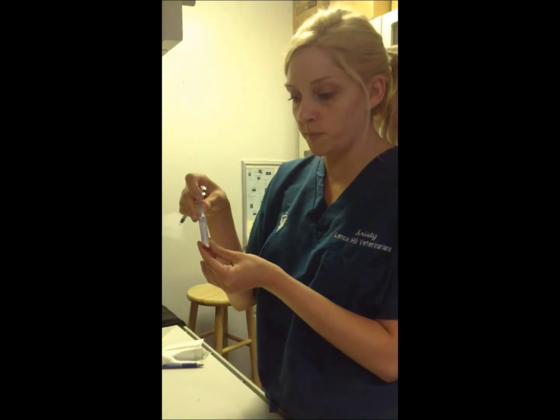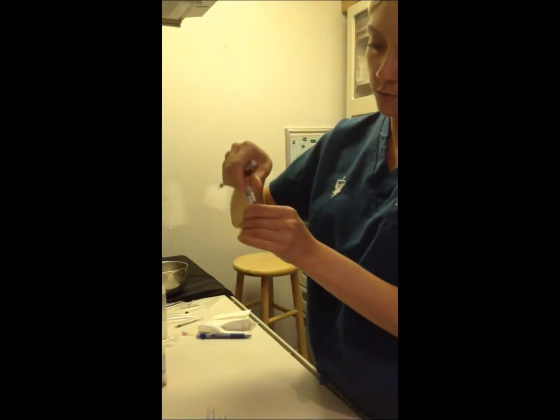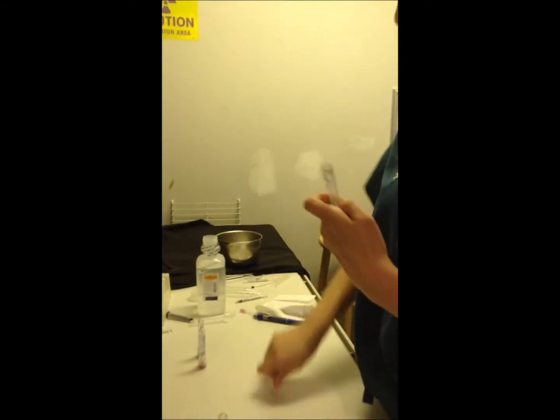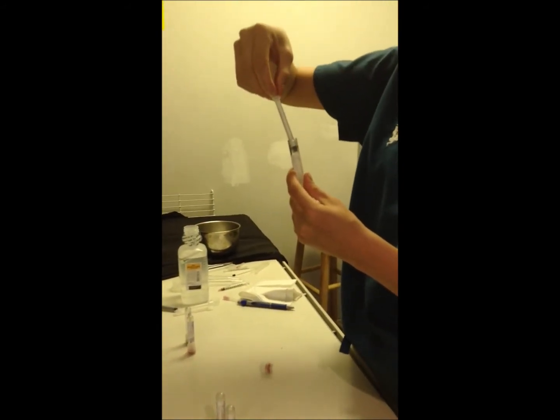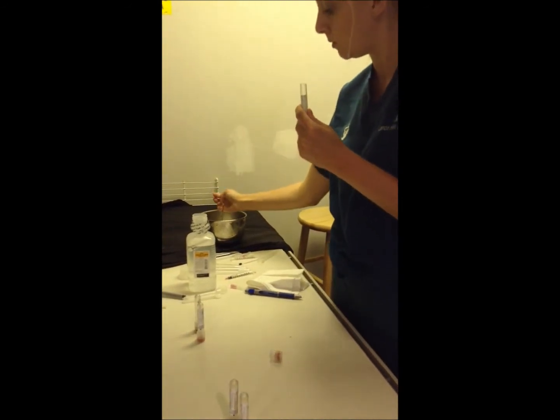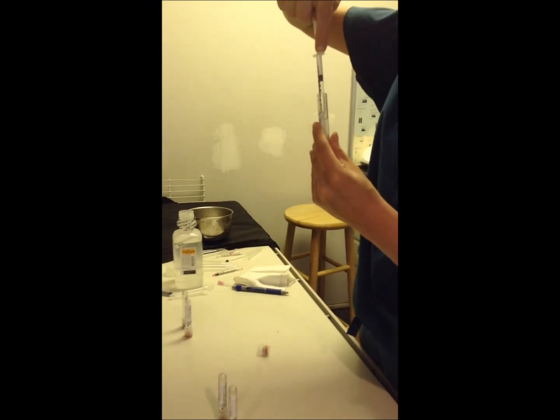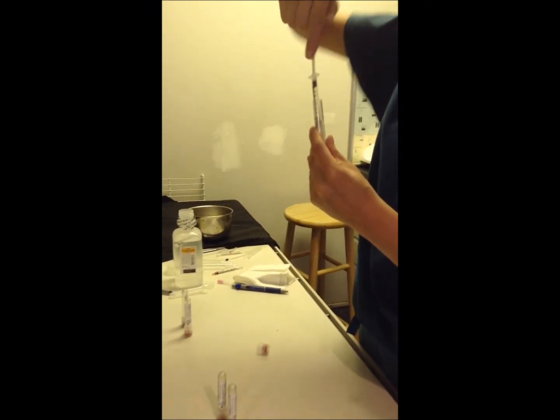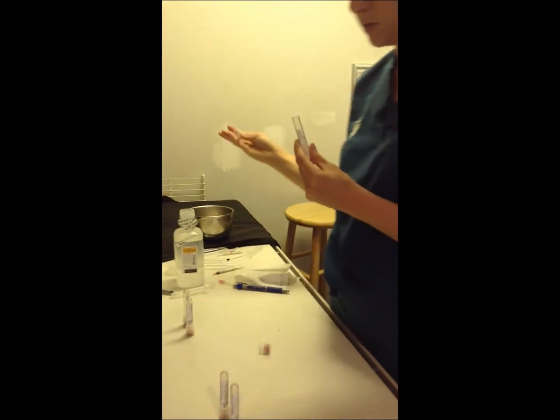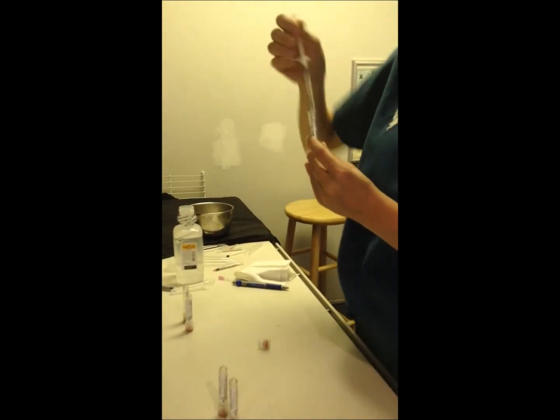I'm gonna do the erythrocyte suspension now. This is Ruby's, the donor. We're gonna remove the supernatant off of the top. And then we're gonna place 0.02 mLs of the erythrocytes and 0.98 sodium chloride into another vial, and that will be the erythrocyte suspension.